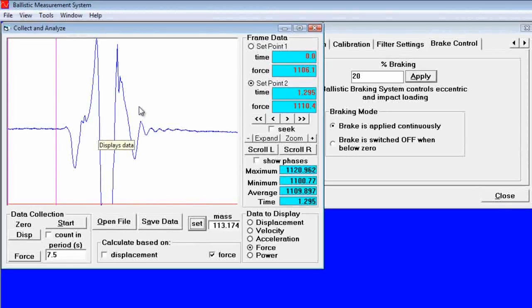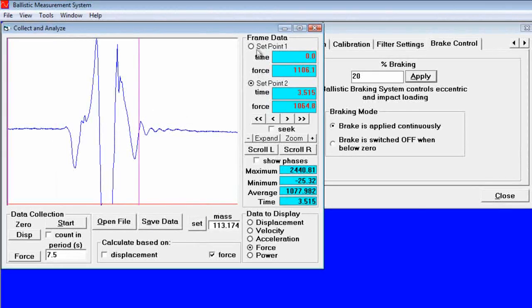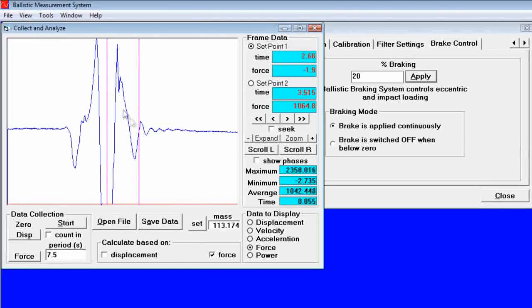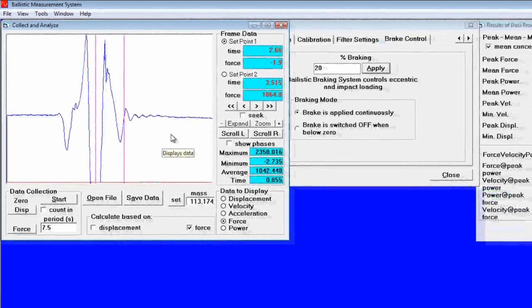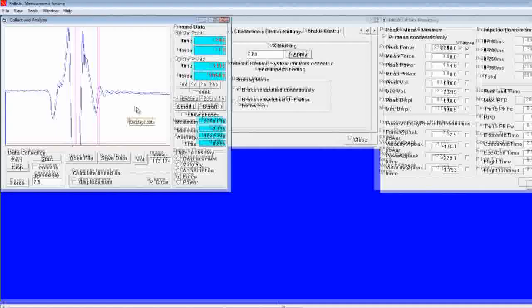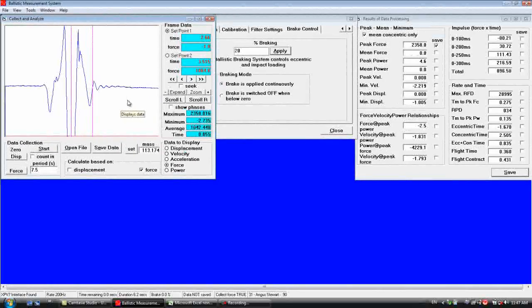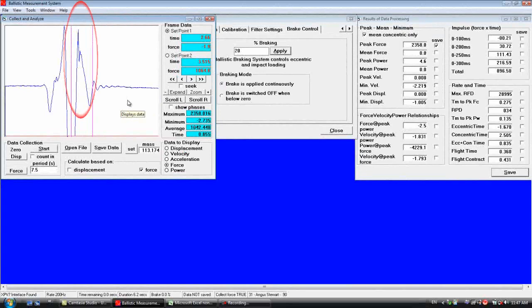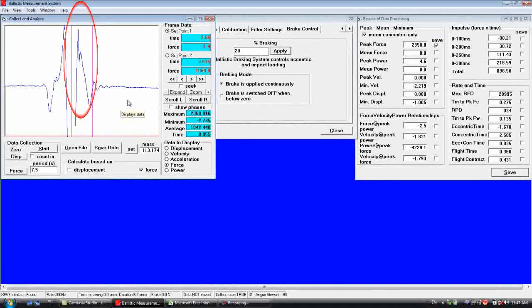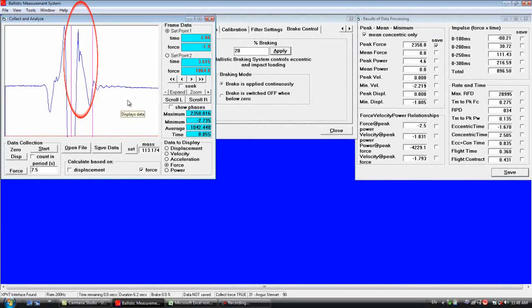In this case, because the landing spike is actually lower than the newtons produced in the concentric phase, we are going to select the individual landing spike as shown here with set point 1 and set point 2.